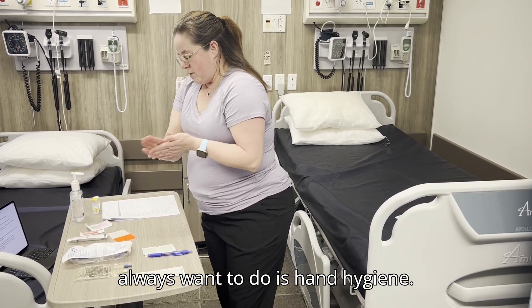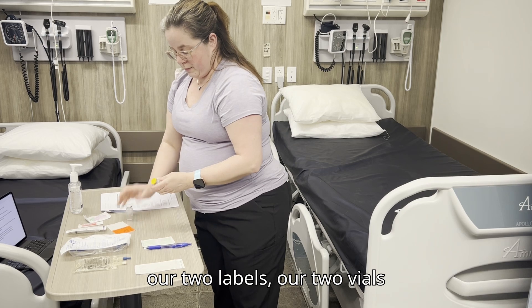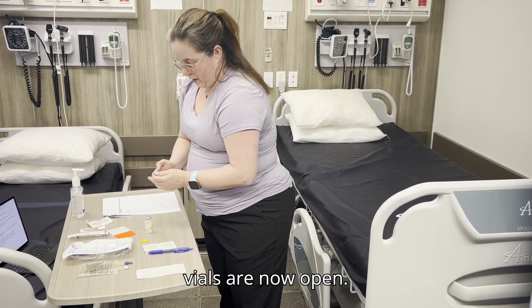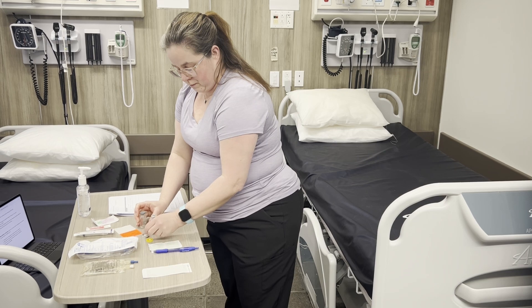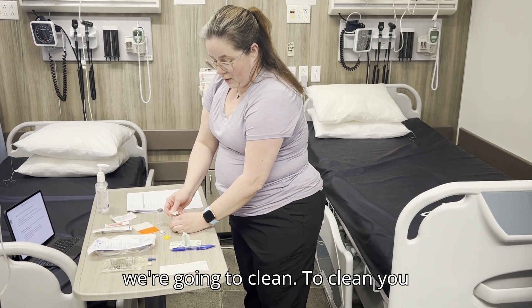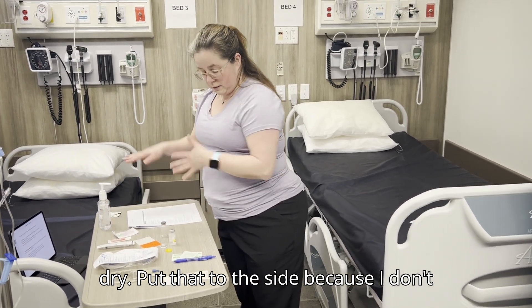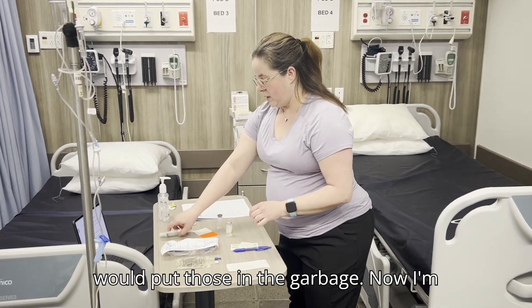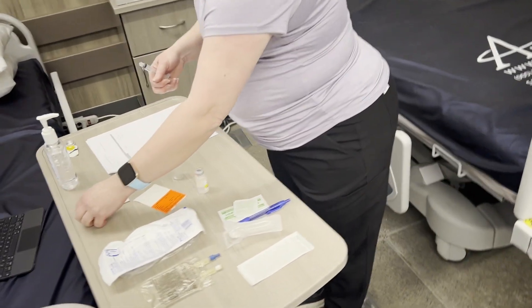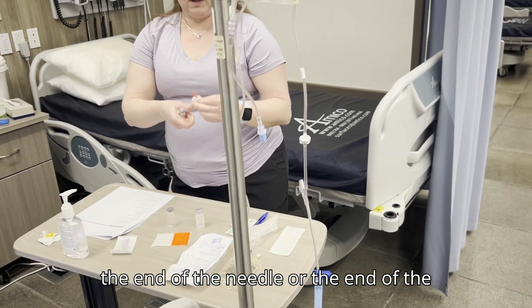The first thing we always want to do is hand hygiene — you can't do anything if your hands aren't clean. Then we open up our two vials. The tops of these vials are not sterile underneath, so we need to clean them — you actually have to rub, not just touch, and then let them dry. Now I'm going to prepare my syringe and open my blunt fill needle, ensuring not to contaminate the end of the needle or the end of the syringe.